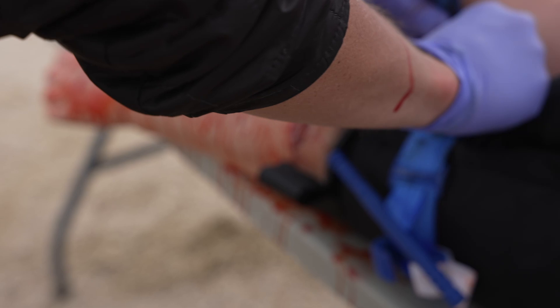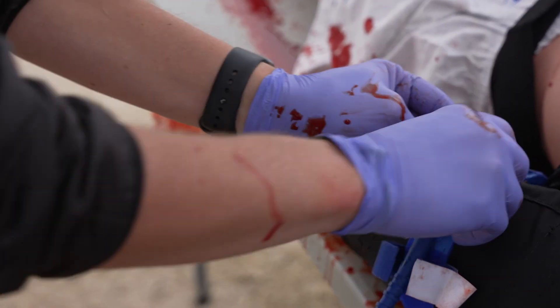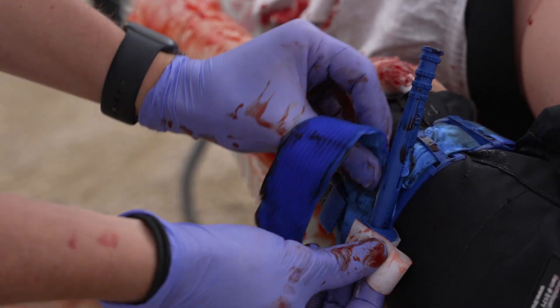Unfortunately, although very safe in many situations, tourniquets do have complications. First and foremost, there's pretty extreme pain for whoever it's applied on. Second, if it's on for a prolonged amount of time, you have cellular metabolites that build up from anaerobic metabolism in that arm that has no circulation. If that tourniquet is released after several hours, that can flood back into the body and, without proper pharmacology, can cause cardiac arrest and many other metabolic issues. And last but not least, you have prolonged nerve changes to that arm. Yes, if a tourniquet's on too long it can cause loss of a limb, though that risk has been relatively overstated — just because a tourniquet's on doesn't mean they're necessarily going to lose that extremity.